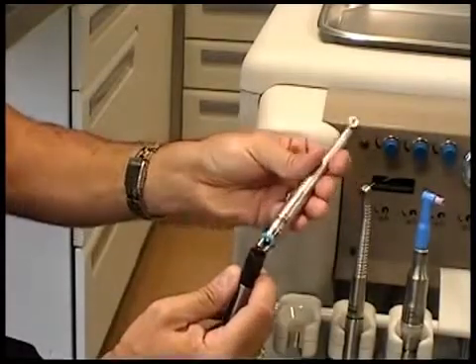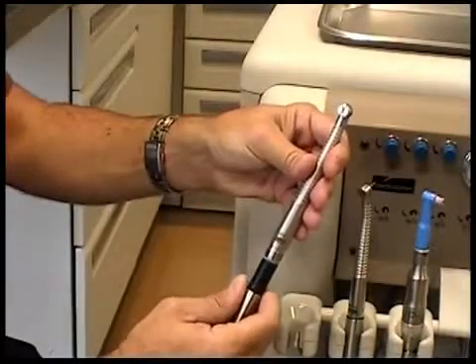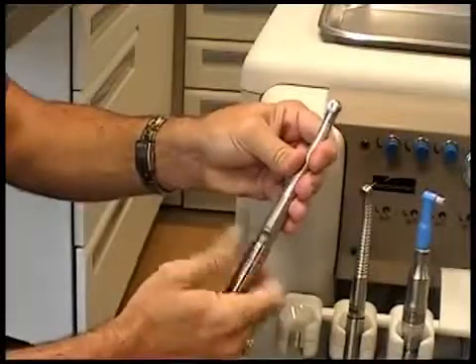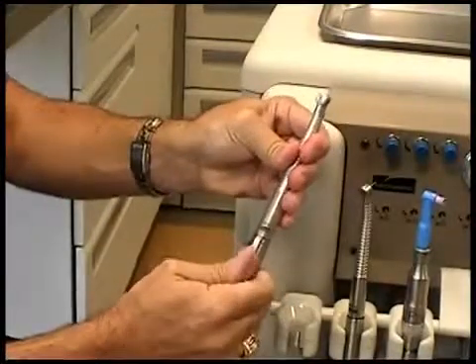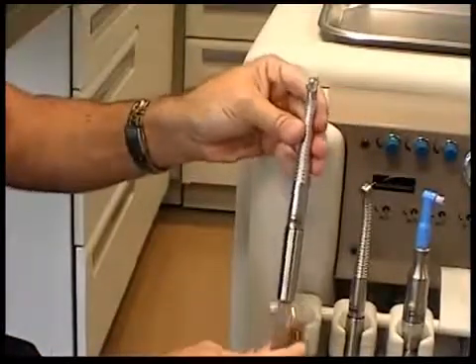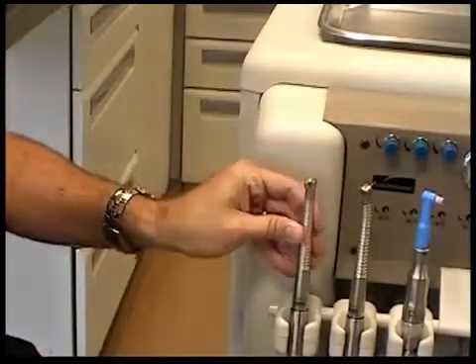First, let's start with the high-speed handpiece, located on the far left, or first position. We install the handpiece by removing the high-speed handpiece head from the box, lining it up with the hose, and securing it to the coupler. Make sure the silver sleeve on the hose covers up the connection.